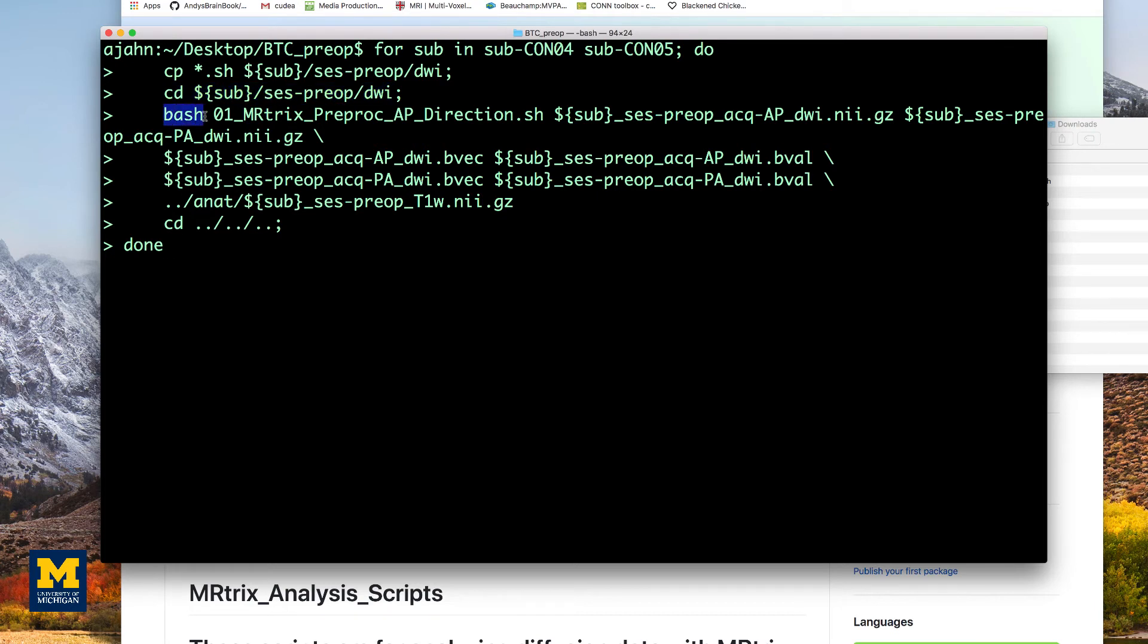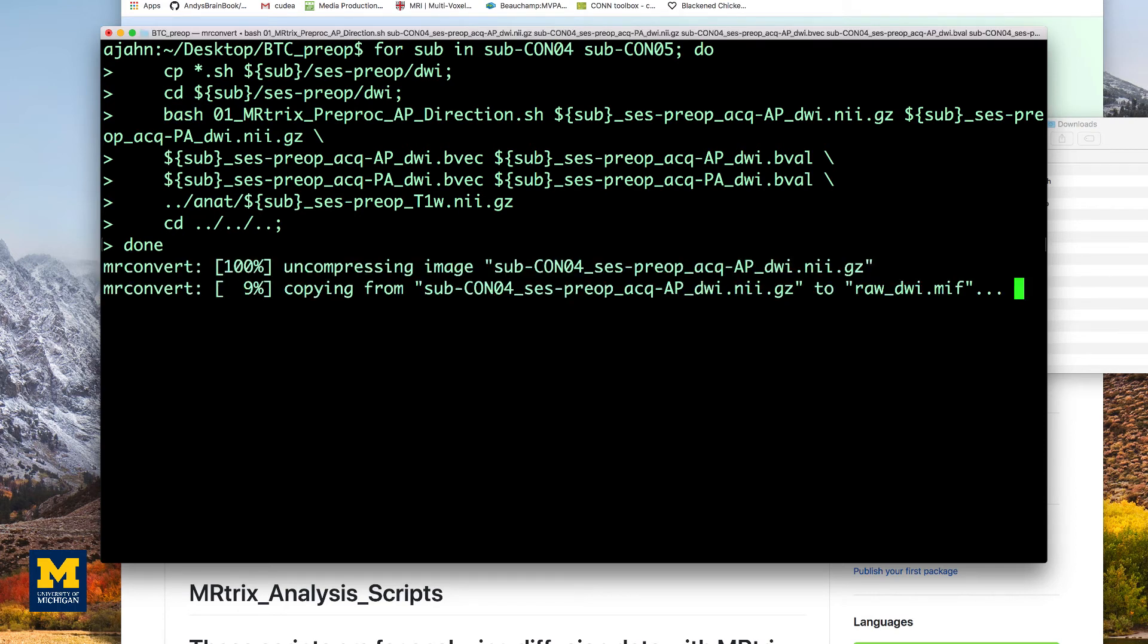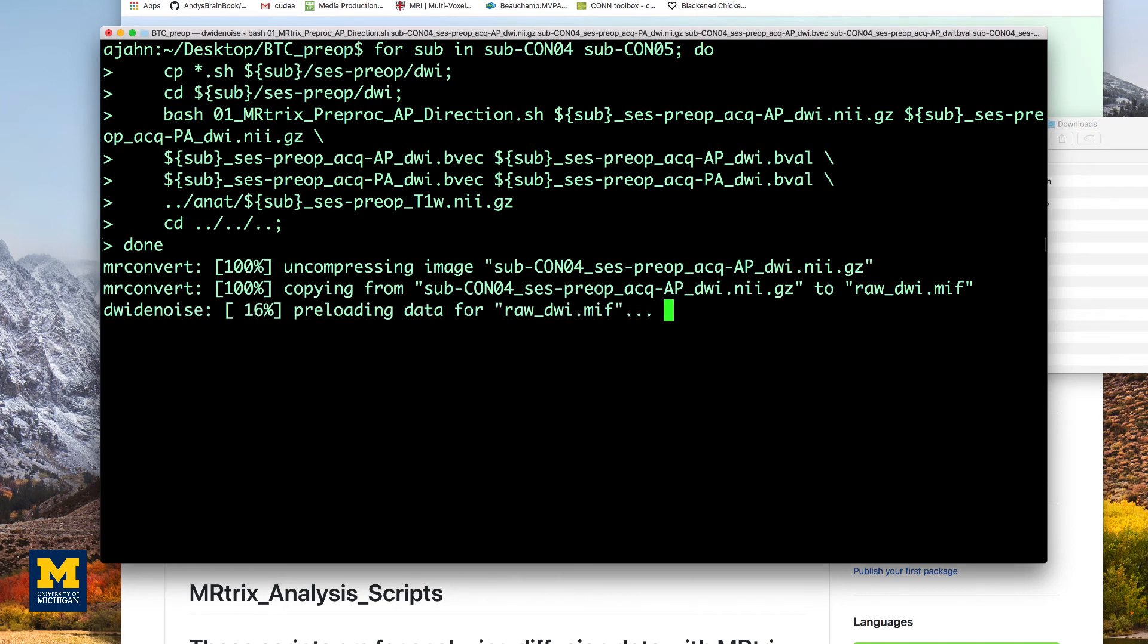The only difference is that we replace the subject name with a variable sub, which will be filled by whichever subject name is in the current loop. This will take some time, so I'll fade out here.